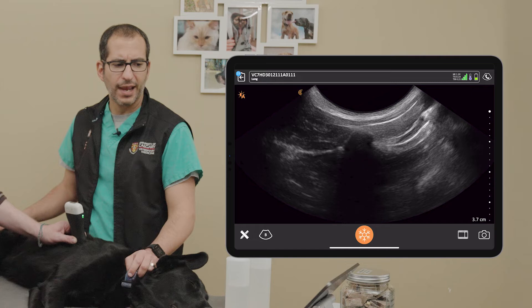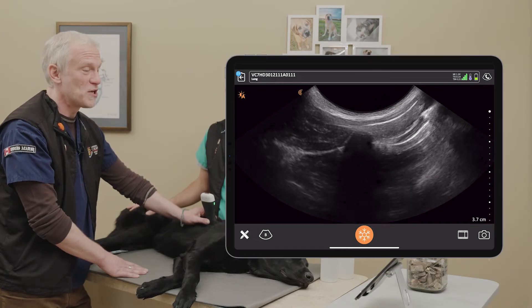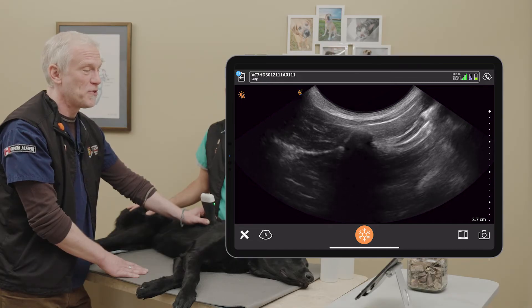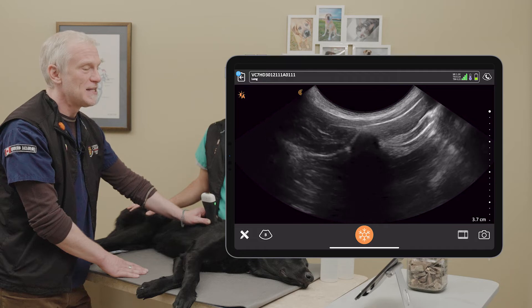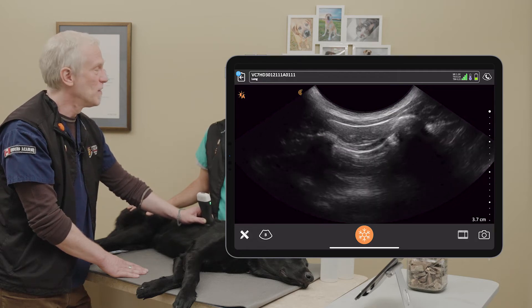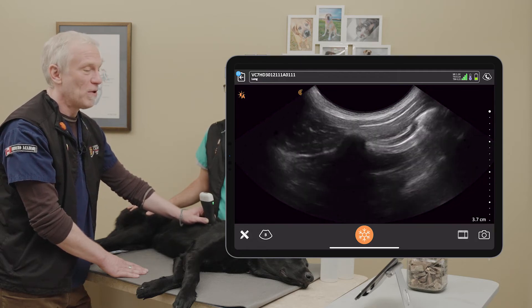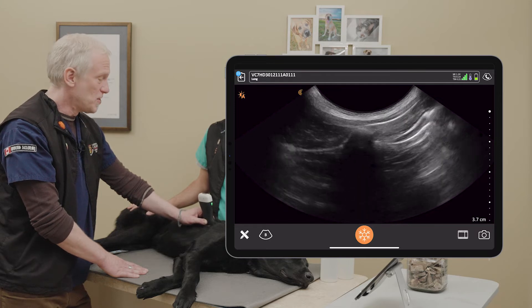So those are the four tricks: play with your depth, play with your gain, play with fanning, and situate your probe over one rib as opposed to between two ribs. All of that will allow you to see that lung sliding more easily.